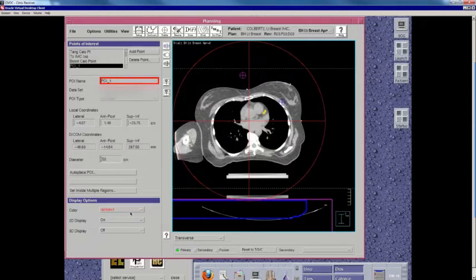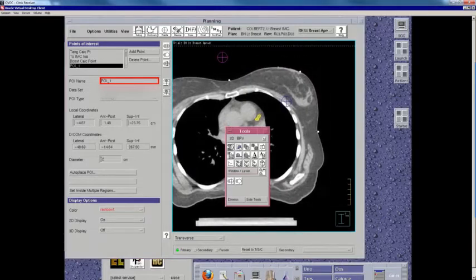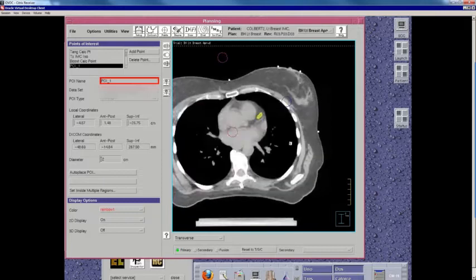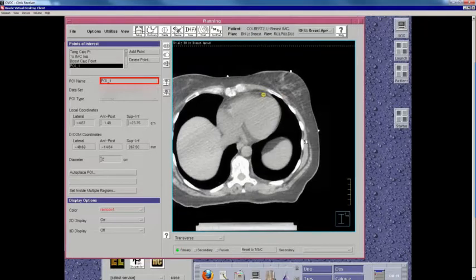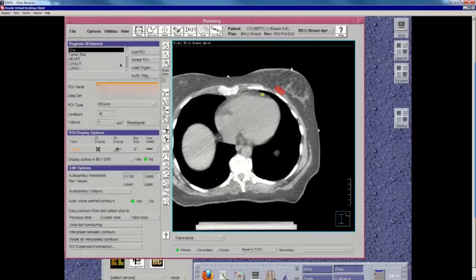So then, there's this mantra in radiation oncology of target, technique, dose, which is an extraordinarily helpful conceptual framework for thinking about how you go about treatment planning in any part of the body. So for this patient with early breast cancer, the target is really the tumor bed. Well, the initial target that we want to contour is the tumor bed, and then the whole breast is also the target as well. So in this particular patient, Lauren probably did all the work, so she contoured the tumor bed.